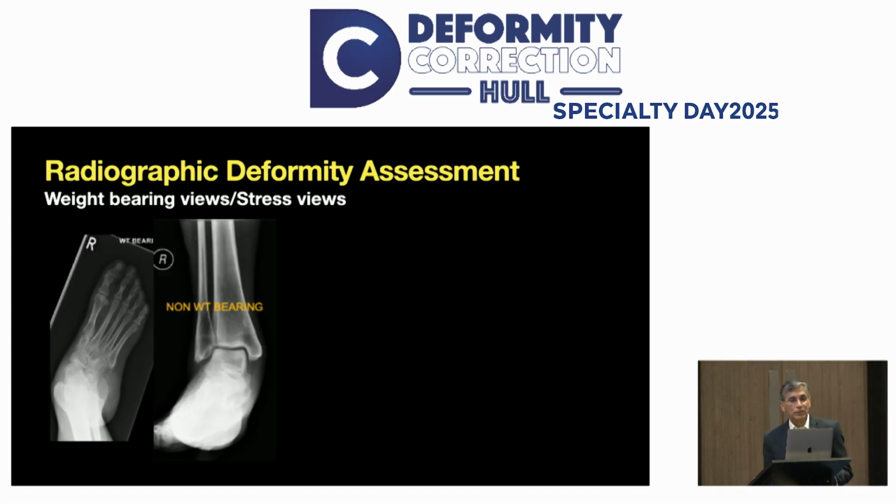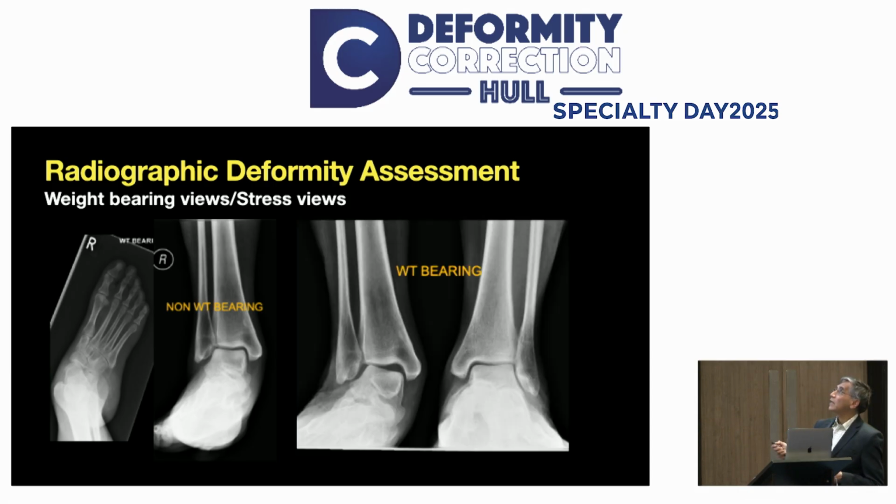So here is a patient I saw in clinic. She had a severe valgus deformity from post-polio paralysis. She was literally walking on the medial border of the foot. And I requested X-rays, and these came back. When I asked her, she said, yes, I was made to stand, but they couldn't do my ankle X-ray, so I was lying down for it. It wasn't adding up with the clinical exam, and then I sent her for weight-bearing X-rays to see the difference. That's very, very important to take on board. If you didn't know clinically, you would be in trouble.